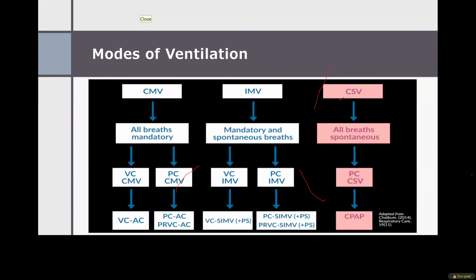We use the Hudson prongs in one unit that I work, and Inca prongs in another unit that I work. And I don't know what you have over there, but I think the prongs work very well. Especially, we start CPAP in the delivery room. We do not intubate babies at all, as much as possible. So the baby comes out, initial resuscitation, and then CPAP right away. Even if we give surfactant, we give surfactant and then put the baby on CPAP right away. So the prongs are usually the starting point in the delivery room, and then we move the baby to the NICU. As the baby gets older, based on the pressure and all that, we change to masks and other kinds of CPAPs.